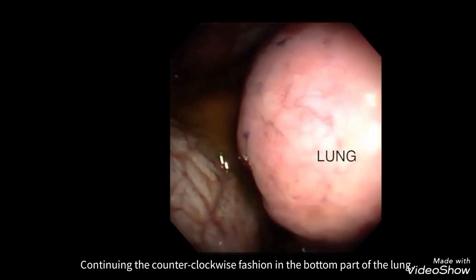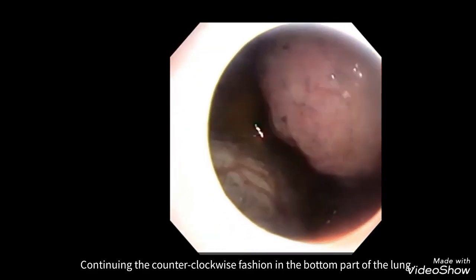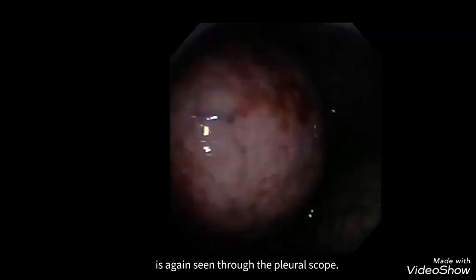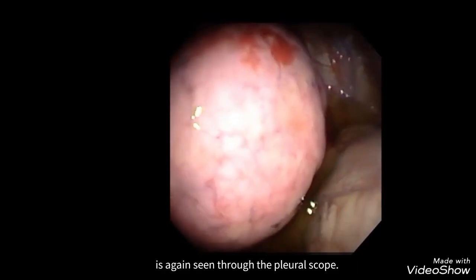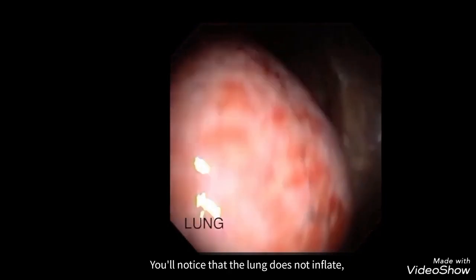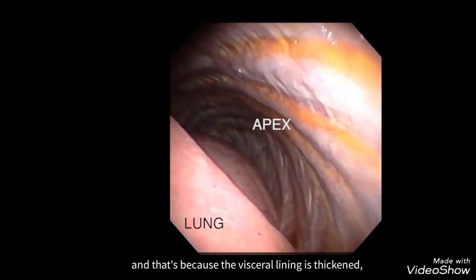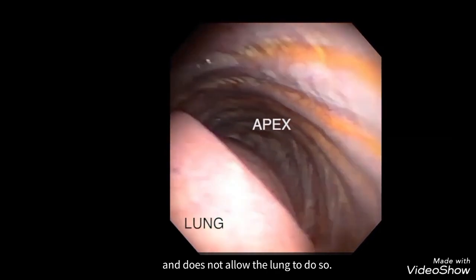I'll continue in the counterclockwise fashion, and the bottom part of the lung, or the base of the lung, is again seen through the pleuroscope. You'll notice that the lung does not inflate, and that's because the visceral lining is thickened and does not allow the lung to do so.